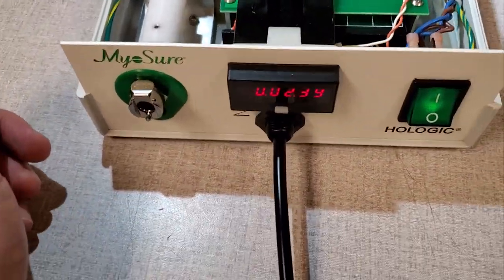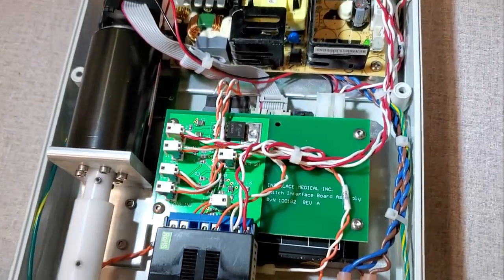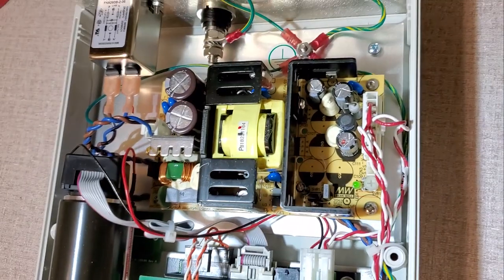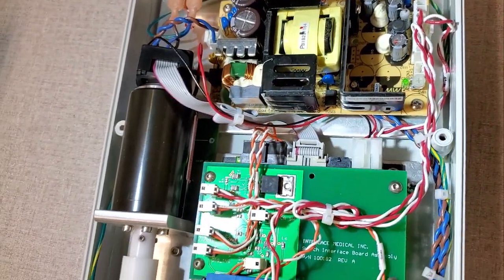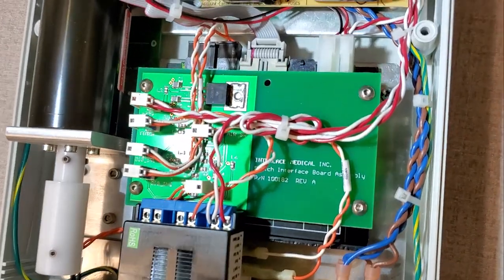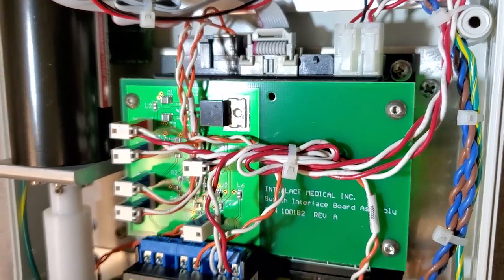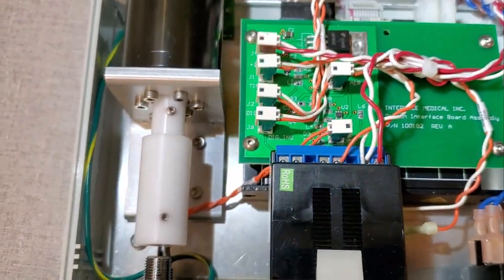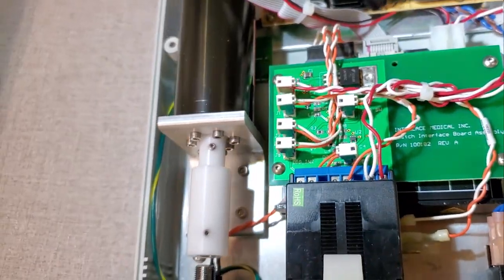So this is a MyoSure. It's a very interesting little unit. Simple motor, simple encoder, simple power supply. Power supplies always go bad. I would check that guy if this thing's not turning on. And you can tell everything is nice and out in the open, very easy to troubleshoot, although I've never really had any problems with these devices before. That's the MyoSure.